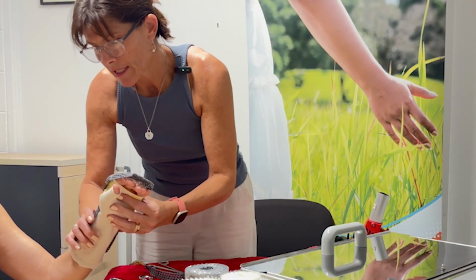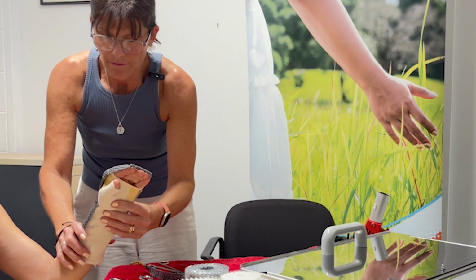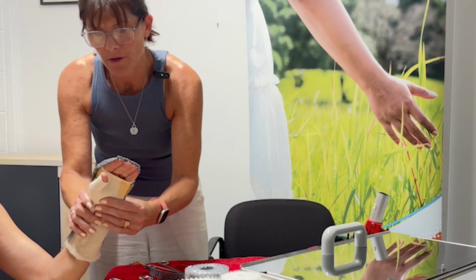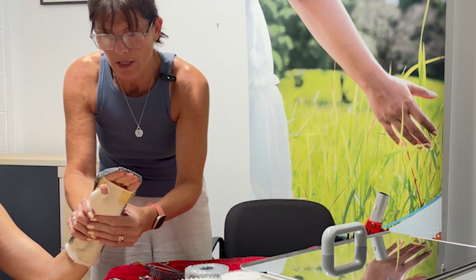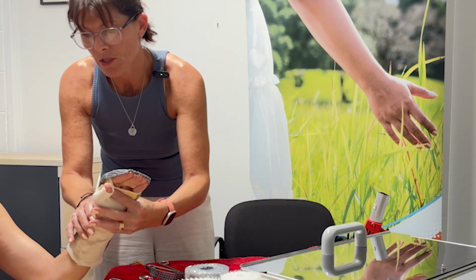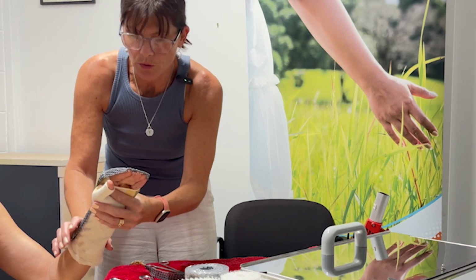So what you've got is a very light, comfortable, well ventilated splint that's very, very firm. There's no way you can straighten your fingers out of that splint. Then you'd put your straps on just as you would for a normal dorsal blocking splint.